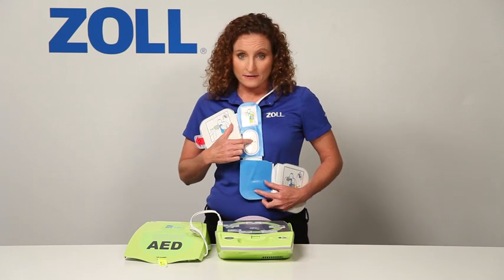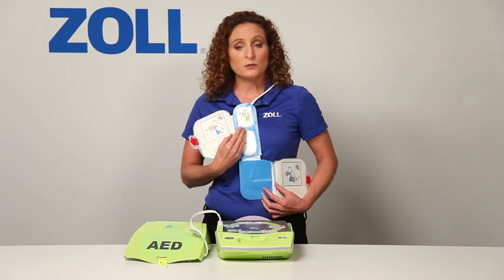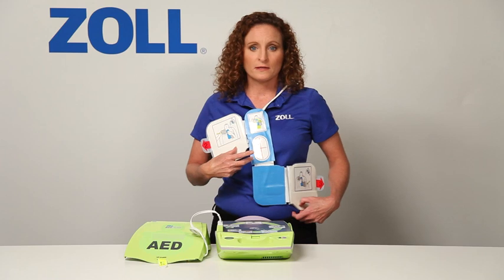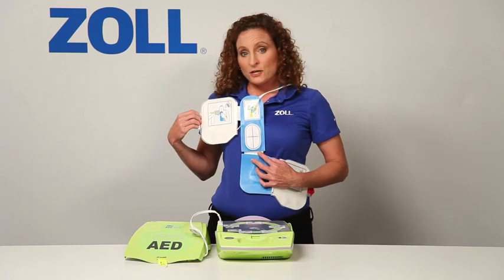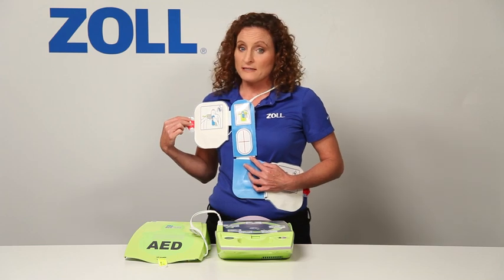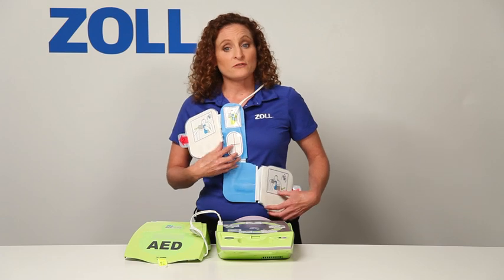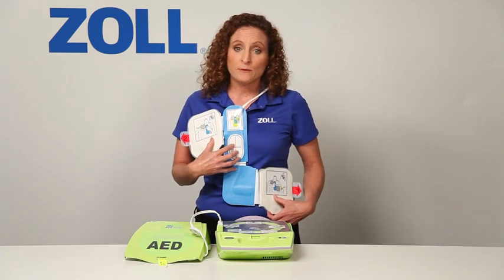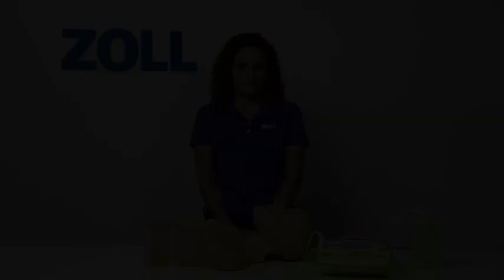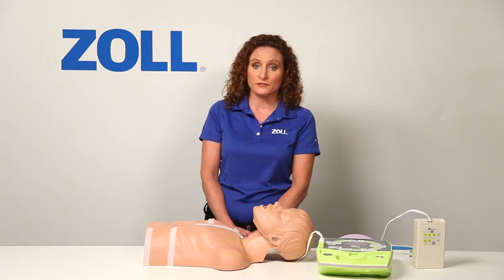The red crosshair is a placement landmark. Put it in the middle of the chest, directly between the victim's nipples, and the two electrode pads will fall into place naturally. Pull on this tab to uncover the gel on the pad and allow it to make solid contact with the victim's skin. Pull on this tab to attach the other electrode pad. Once the pads are attached, CPR can be done by putting your hands on the red crosshair and doing chest compressions.